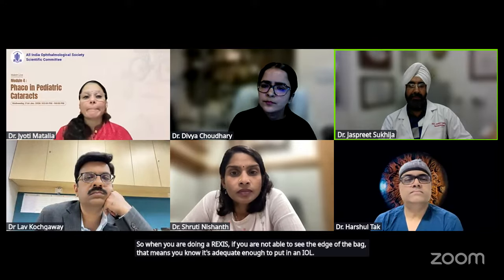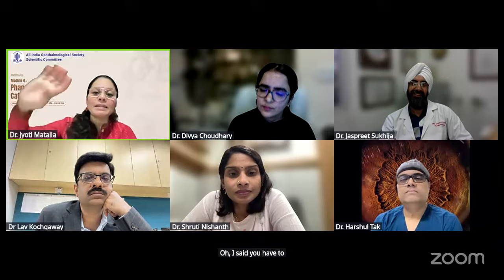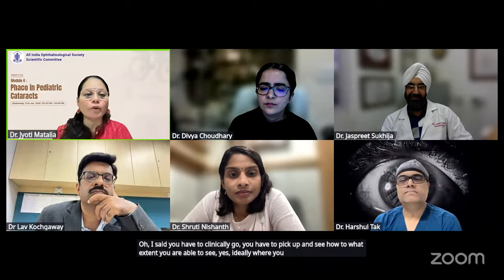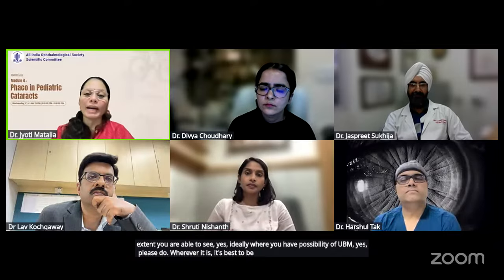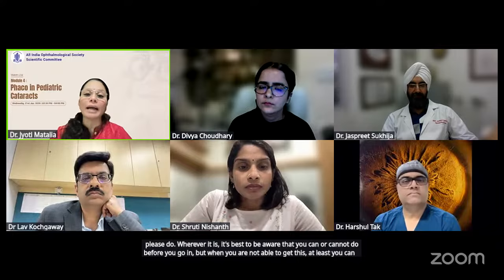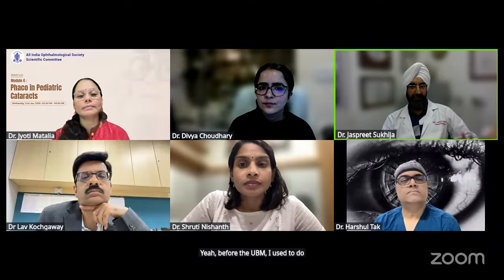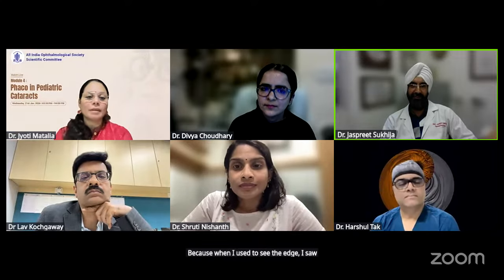But in these children, sometimes the pupil doesn't dilate, and so you have to go clinically. You have to see to what extent you're able to see. Ideally, where you have the possibility of UBM, yes, please do. Wherever it is, it's best to be aware before you go in whether you can or cannot do it. But when you are not able to get this, at least you can look clinically. Before UBM, I used to do that and leave them without an IOL, because when I saw the edge, I saw the bag was small.